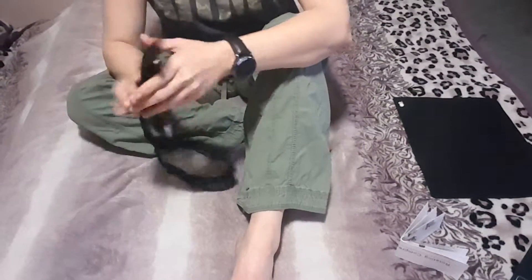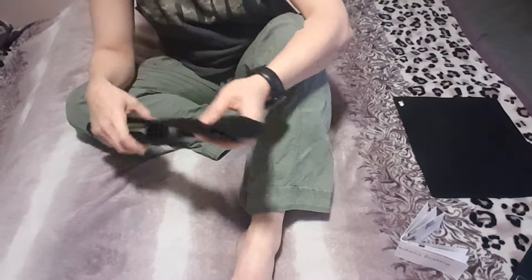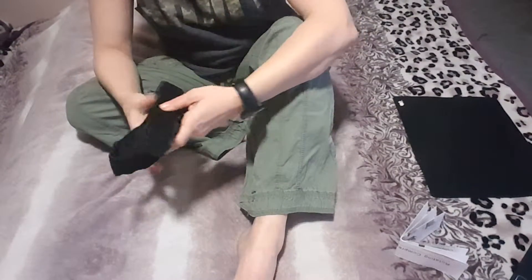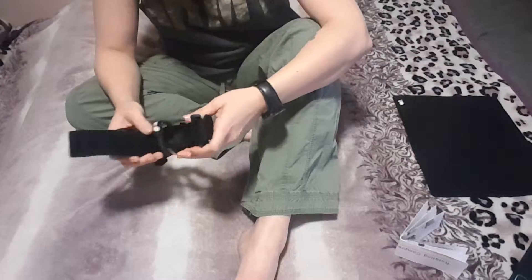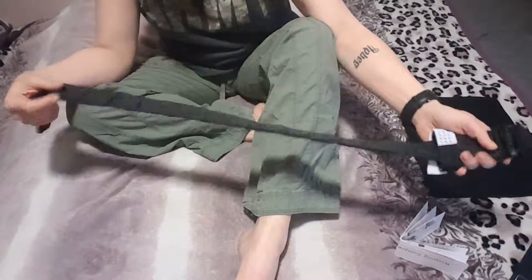Welcome to Black Sheep Logger. Today I'll be reviewing the ADSX Rescue Military Issue Combat Application Tourniquet for hunting, hiking, first aid, and survival. It's something everybody should have in their trauma kit.